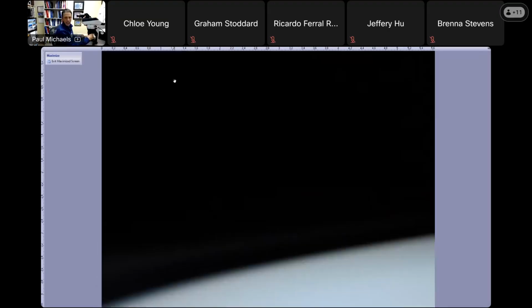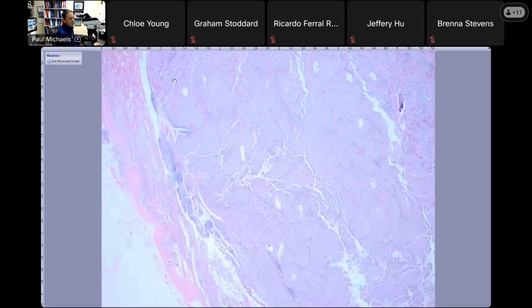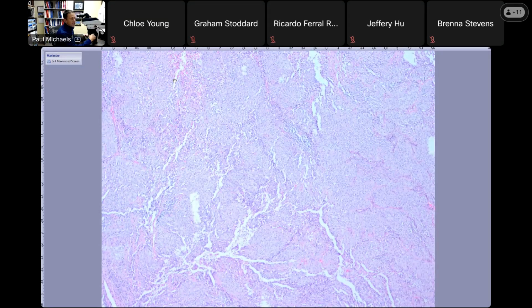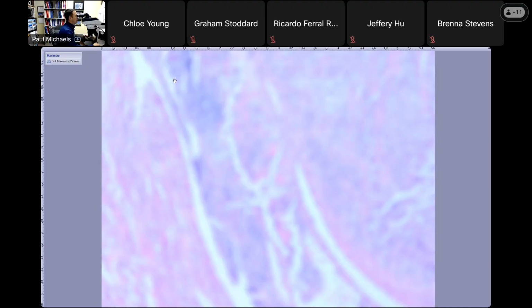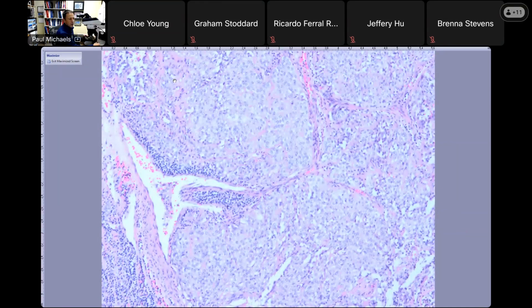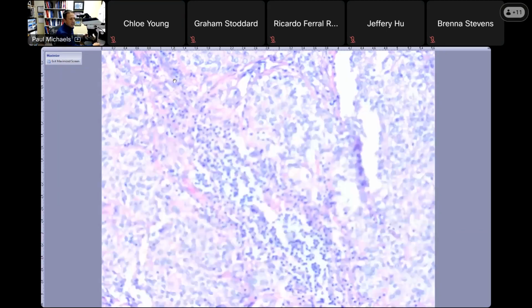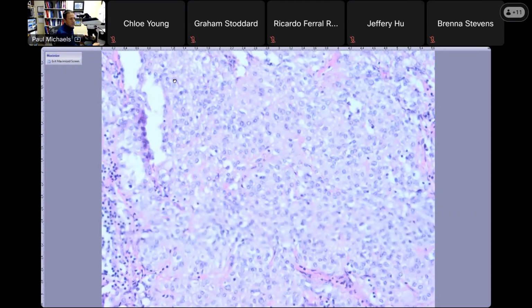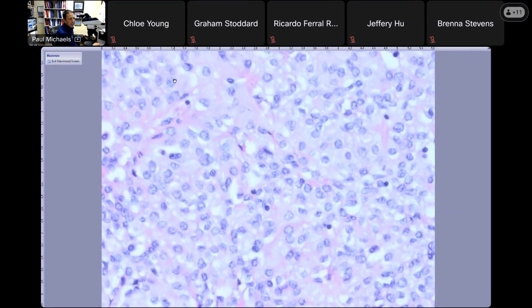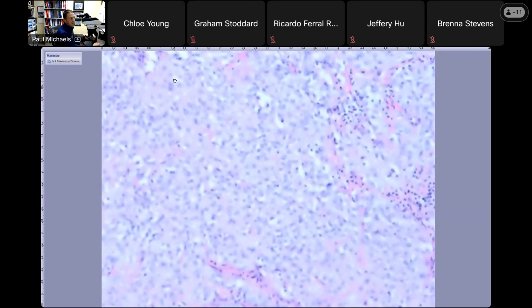Okay, one last case, and it's case number 1. This is a case that I didn't see when it was worked up. This was a case in Austin where several good pathologists in our group had looked at this case. It's an adrenal gland. This tumor is within the adrenal gland. Here's the outside of the adrenal gland cortex, and then here's this tumor. Kind of a solid nested pattern, some lymphocytes. Kind of oval to round nuclei, hypochromatic, bland chromatin pattern, not coarse, no mitotic activity, very rare mitoses, no glands.